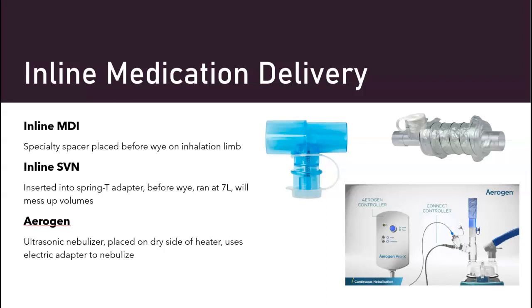by an SVN. A lot of times while I'm nebulizing it, that's when I'll wipe down my ventilator and futz around, make my room look nice, make sure all my circuit looks good, make sure all my heater wires look nice, triple check that my patient looks nice, and my emergency equipment's good to go if I need it. Just basically all my pre-shift, my first shift things I'll check while that's nebulizing, because it doesn't take very long.